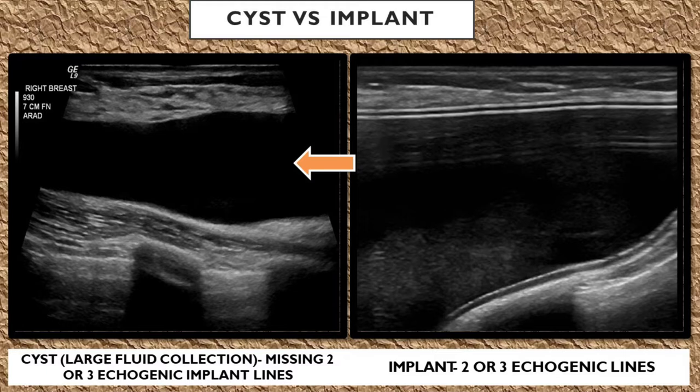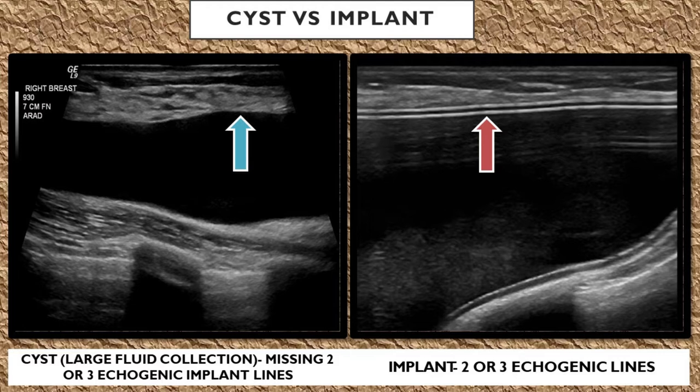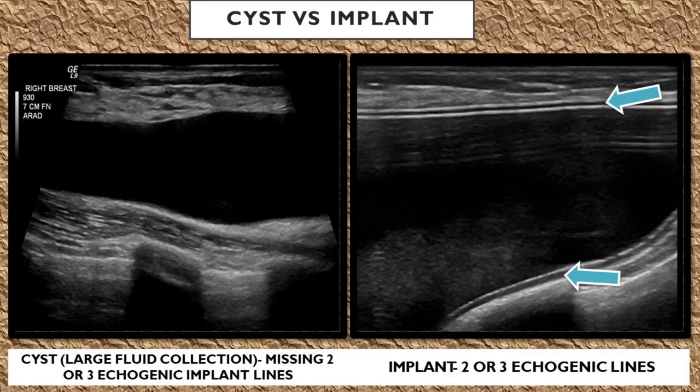With a large breast cyst or a large fluid collection in the breast like a seroma, the walls of that cyst are not going to be bright and echogenic. It's going to be missing the triple line sign or the double line sign of the echogenic implant shell walls. With an implant, you're going to clearly see the bright echogenic double line sign or triple line sign, with the anechoic lucency in between those lines. This is the way to tell between a large fluid collection in the breast and a breast implant.